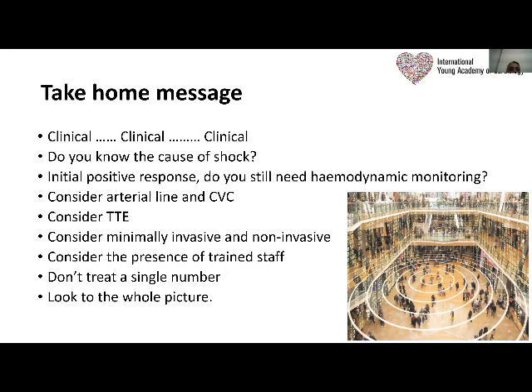Echo is very important, and I think the next topic with Dr. Hatem Sulaiman will be very interesting about the role of echo in hemodynamic monitoring. Start with non-invasive and minimally invasive methods. Consider the presence of trained staff, especially the nurses over the night. Don't treat a single number; it's the whole picture.